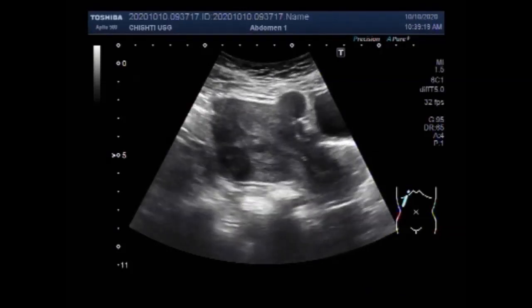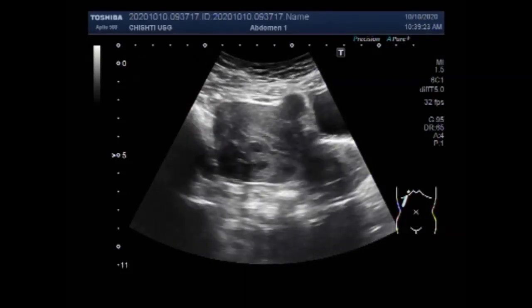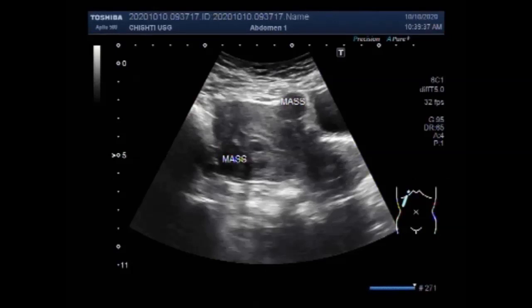You can see multiple fibroids along the posterior wall. A fibroid is also seen along the anterior wall of the uterus. In this case, you can see the fibroids are round to oval in shape, semi-solid to solid in consistency.